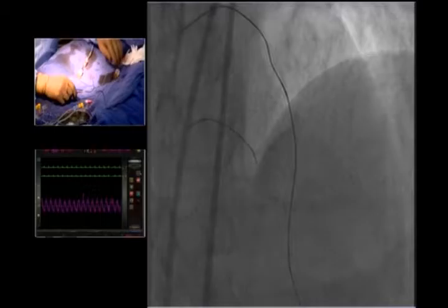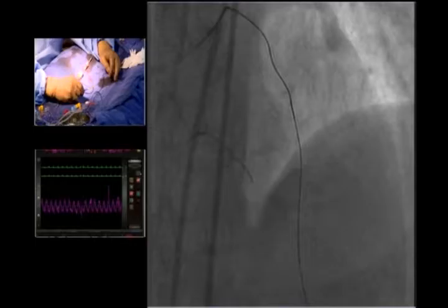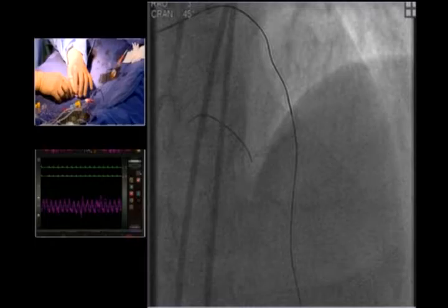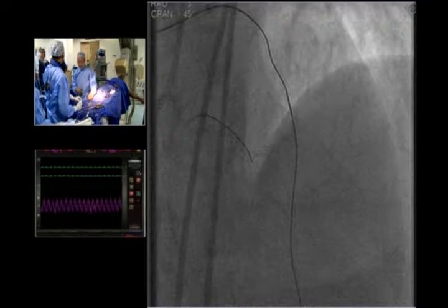Yes, you're across. So now I try to cross this with the microcatheter. Can I see the guiding catheter? I'm pushing the guiding catheter deeply and trying to cross this Caravelle. Very slowly it's going in. So now I try to cross this. But impossible. In this kind of situation, I want to take the very small balloon.